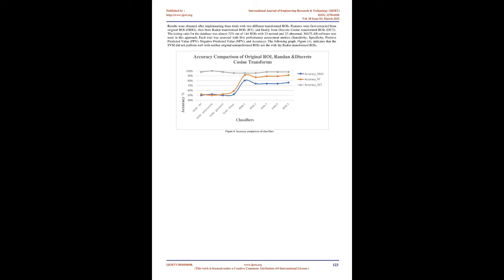Their CADE calculated parametric features extracted from ROIs using statistics, histogram, GLCM, and wavelet techniques. To study the significance of features, the sequential forward selection, SFS, technique is used. Many types of k-nearest neighbor, KNN, and support vector machine, SVM, classifiers were trained to distinguish between normal and abnormal ROIs.